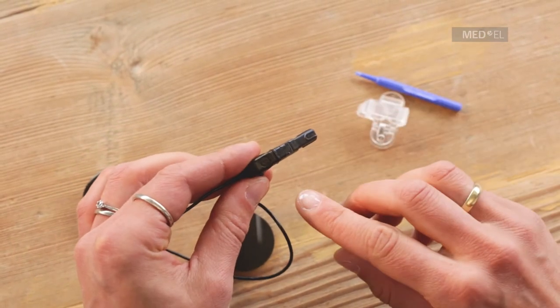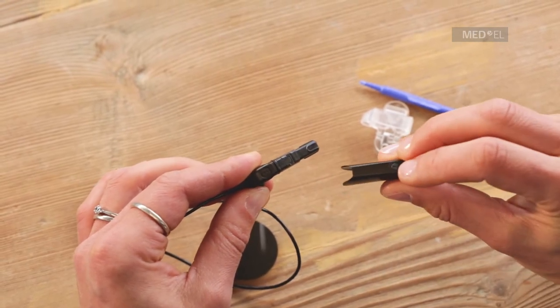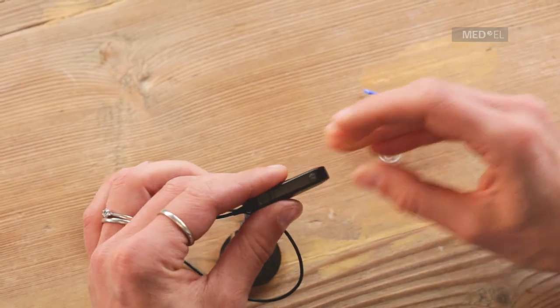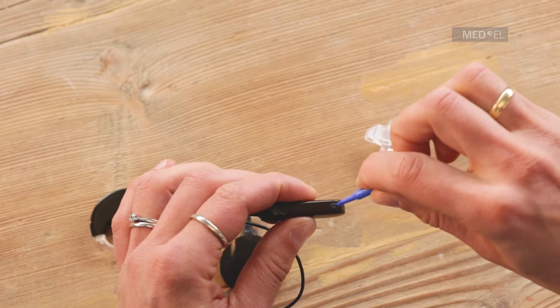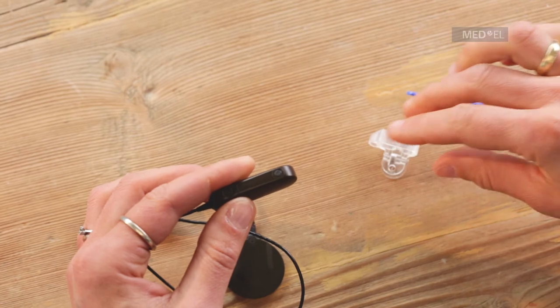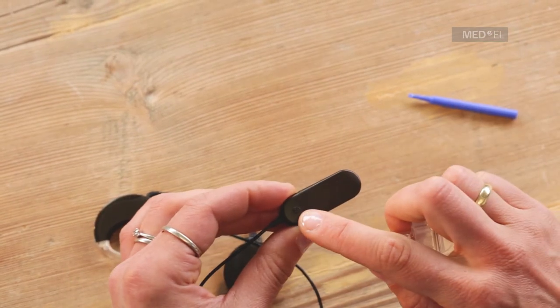Check that the battery pack cover is in the unlocked position, then slide it over the battery pack and lock it into position. Connect the attachment clip by sliding the silicone ring of the clip over the battery pack.